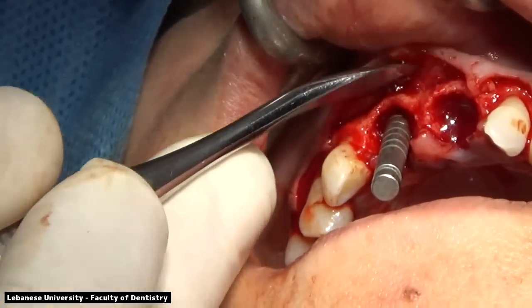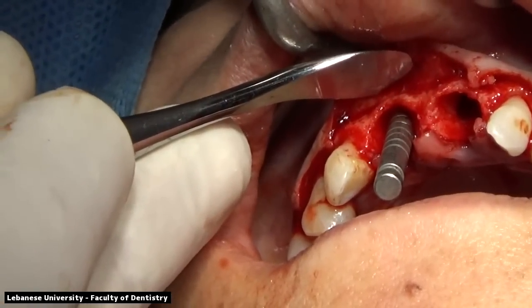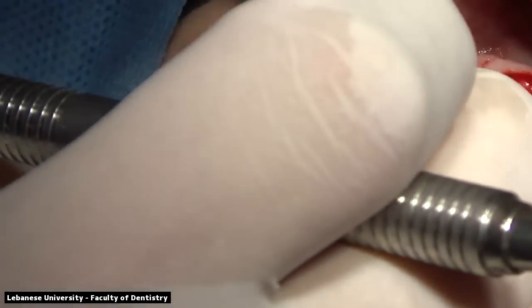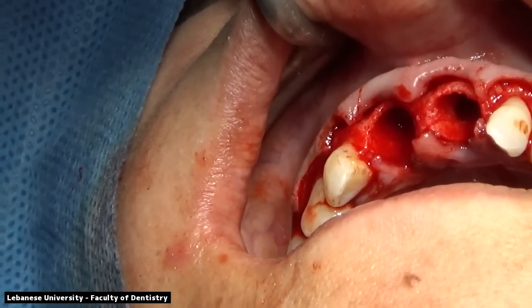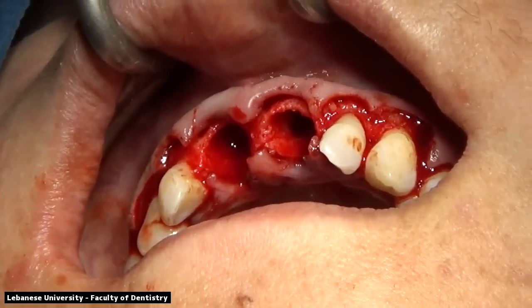And the 3.3 diameter implant will give us enough gap and enough support for our buccal plate of bone, and we can add some bone graft material at the site so that we can prevent the bone loss on the buccal once we have the remodeling, because every single time we do an extraction, there will be a remodeling of the buccal plate of bone. So we're going to use two 3.3 diameter by 12.